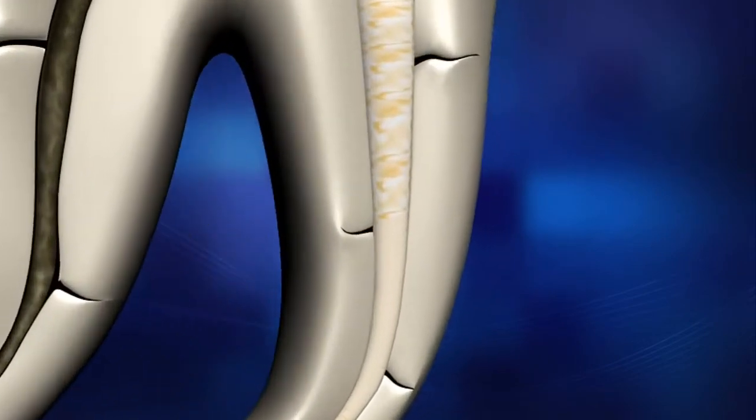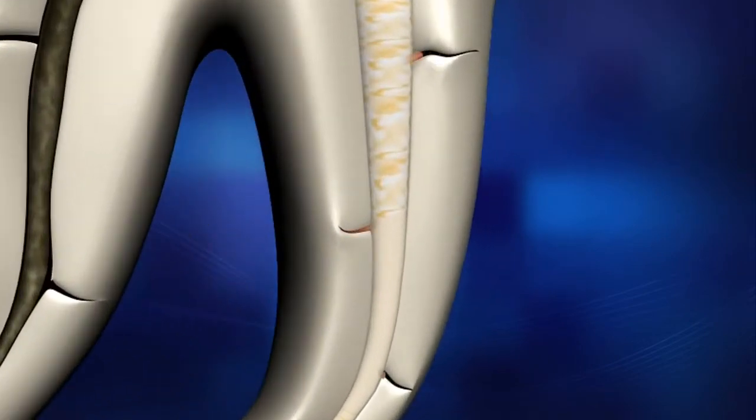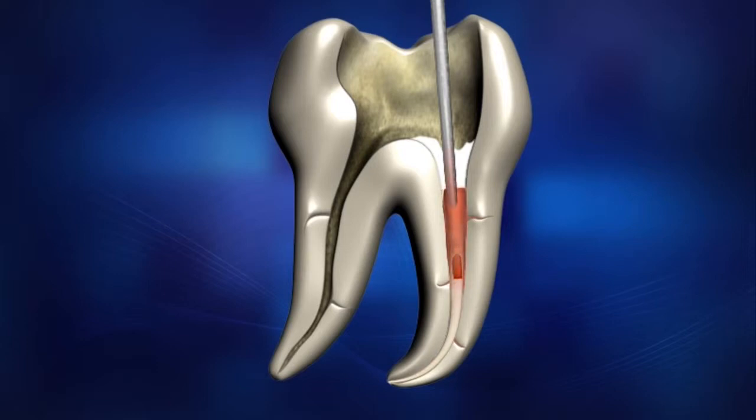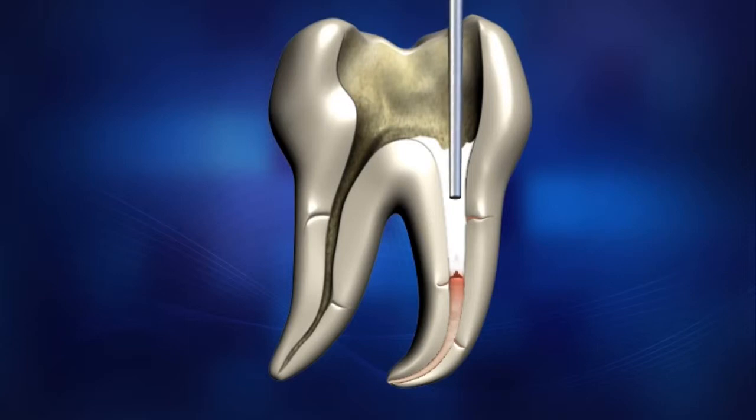Reheat the pen tip by pressing the operation button for half a second. Then release the operation button to allow the pen tip to begin cooling. At the same time, wiggle the unit and remove the tip quickly from the canal. The tip will carry and remove the coronal mass of Gutta-Percha, leaving the apical plug and sealed lateral and accessory canals. Use the hand plugger to condense the remaining Gutta-Percha material.